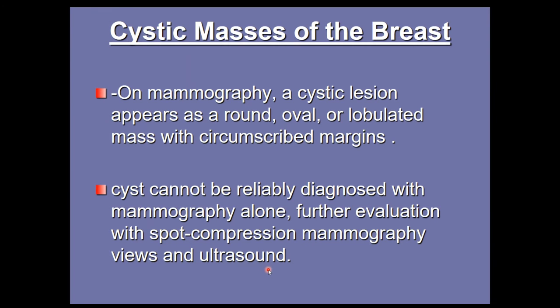Whenever we are suspecting any mass, we always perform ultrasound with it, because ultrasound can easily differentiate a cystic and a solid mass. There is no need for further views or suspecting. We can easily differentiate it.